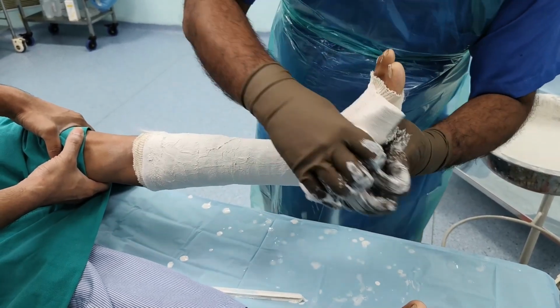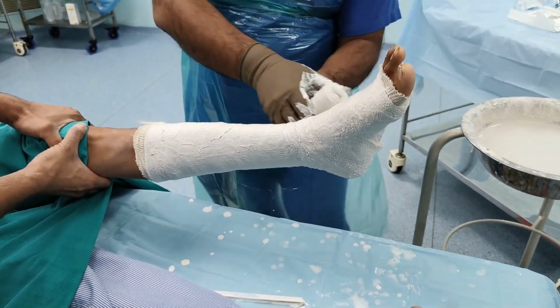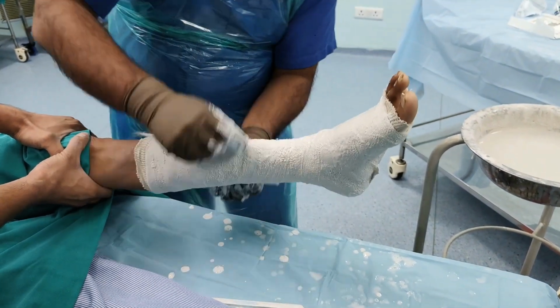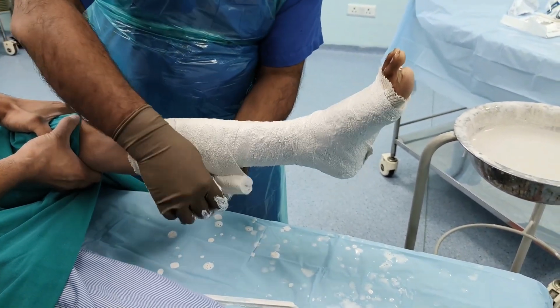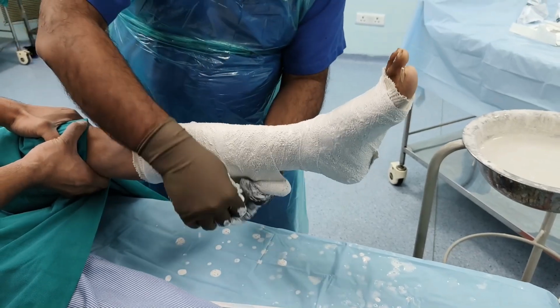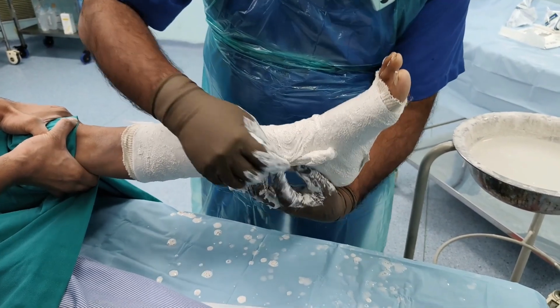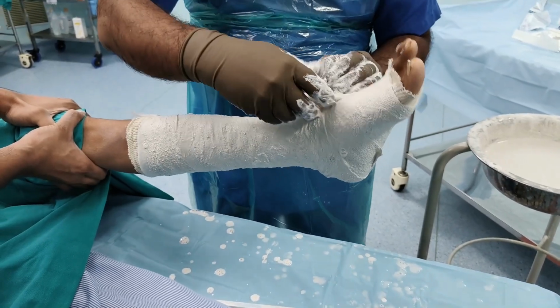I have taken my second bandage and I am wrapping it around, smoothing it out with my left hand. Now, as you can see, the ankle is going into plantar flexion. Before the plaster is set, I have to ensure that this plantar flexion doesn't stay in my plaster.